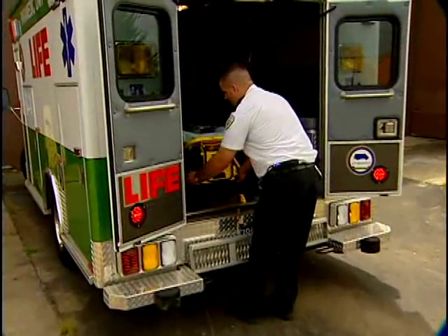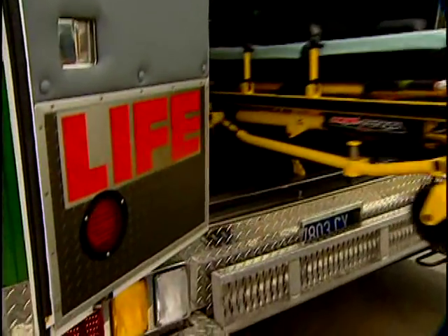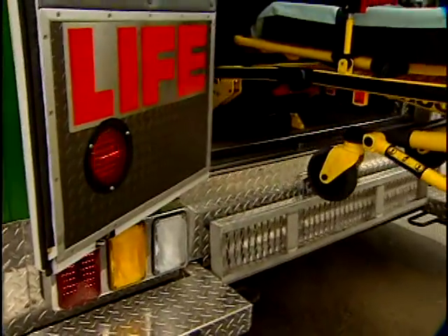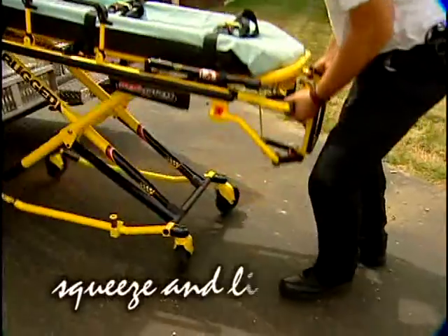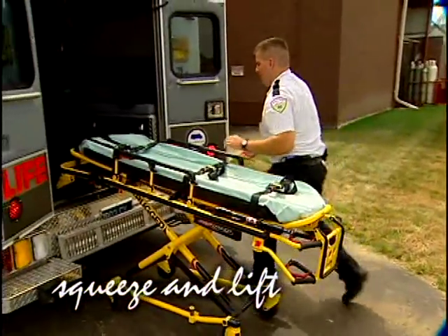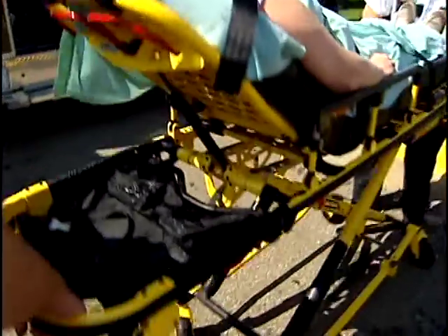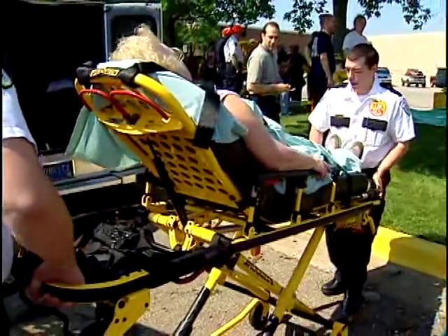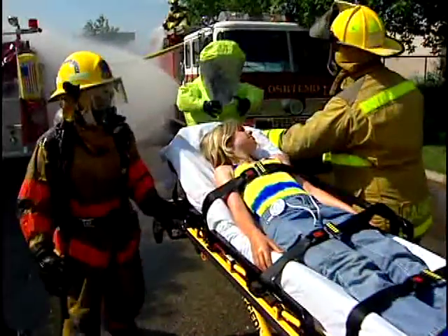Reverse the procedure to unload an unoccupied cot with one operator. Release the cot fastener, roll the cot out of the ambulance until the safety bar engages the safety hook. Lower the foot end to the ground, squeeze the release handle and raise the cot until the legs are fully extended and locked. Disengage the safety bar and move the cot away from the ambulance. As you can see, Stryker's MX Pro is easy to operate, it's rugged, and it's designed to help us do our job. Isn't that everything you really want from a cot?